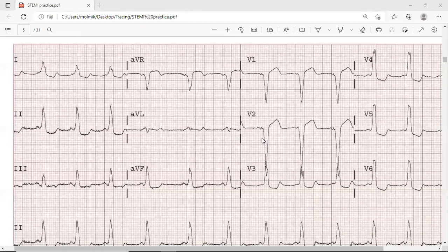There's only one problem. If you know that the patient, for example, is 14 years old, a young one, fine, you immediately know that it's impossible to have MI. But if this patient is 50 or 60 years old, this patient could have MI in addition to the WPW syndrome. Now that's a difficult one, and this is why you need the necroenzymes to measure. So it's not the ECG alone that can be used in this situation, especially if you have some additional problem.